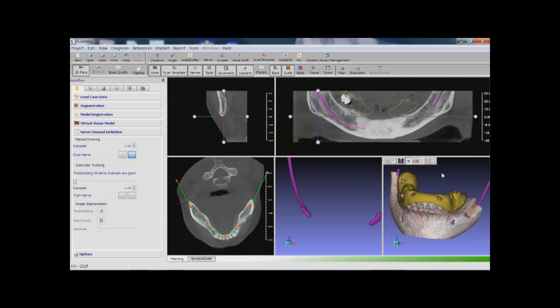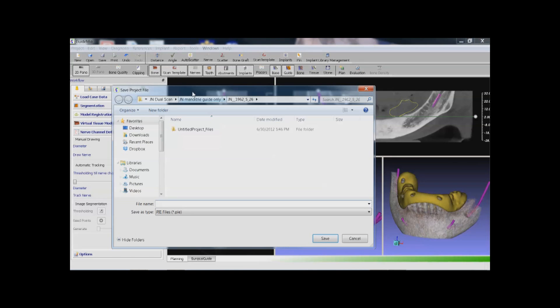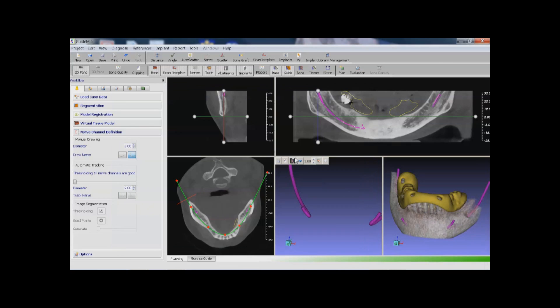After this, we can change the transparency of the bone model so you can see the nerves inside the bone structure. Now I save the project, and this concludes our data preparation for this case.